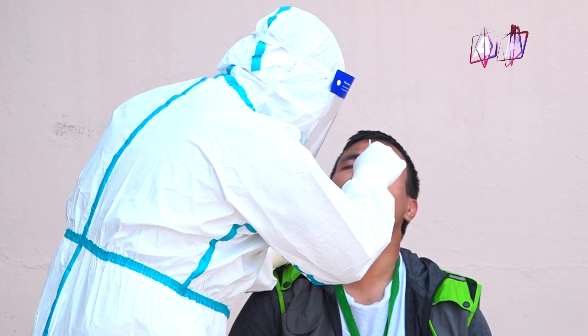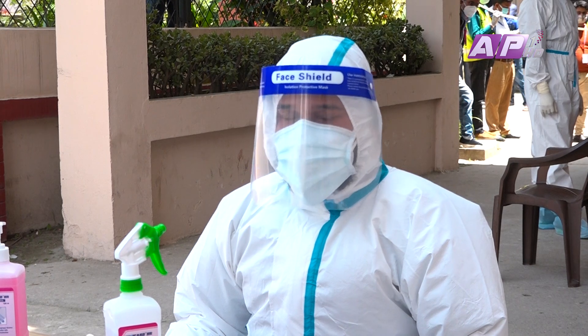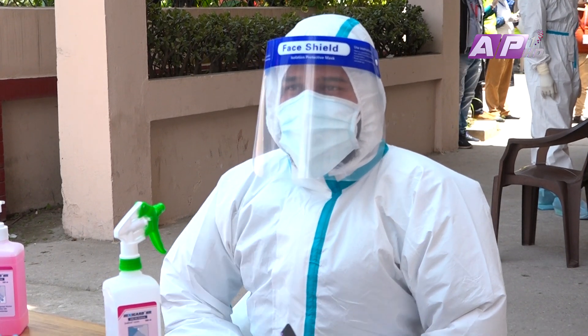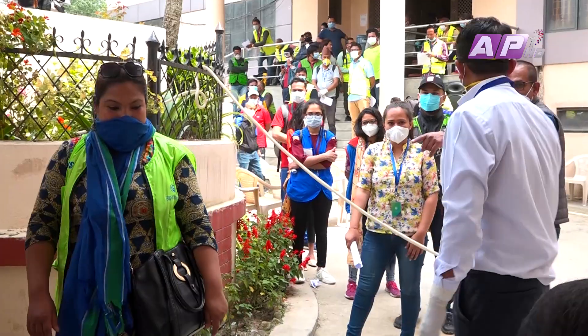Hello, I am Anil Singh. Today I have a sample collection of water and pharyngeal swabs — I have a pharyngeal swab and a nasopharyngeal swab.